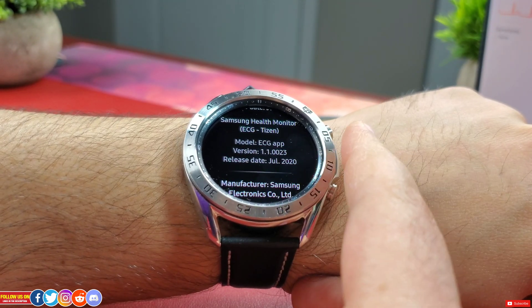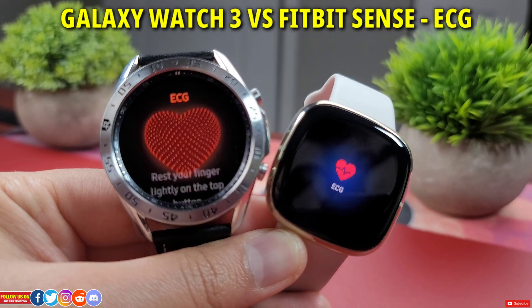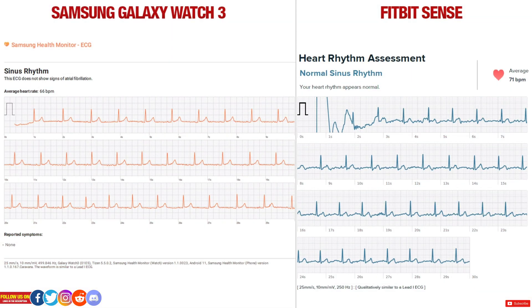Now let's compare the ECG reading from this Galaxy Watch 3 with my Fitbit Sense, which also has an ECG monitor. Both graphs are normal, but you can see the reading from Fitbit is not that smooth. I presume it's because Fitbit uses a 250Hz sensor versus the Galaxy Watch 3's 500Hz sensor — almost double — which is why the graph from the Galaxy Watch 3 is smoother. Both graphs were recorded at 25mm per second. Also, Fitbit does not ask you to input any symptoms at the end of the reading, so out of both these watches I will prefer the Galaxy Watch 3 over the Fitbit Sense.